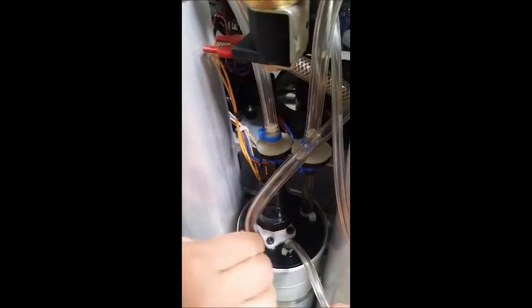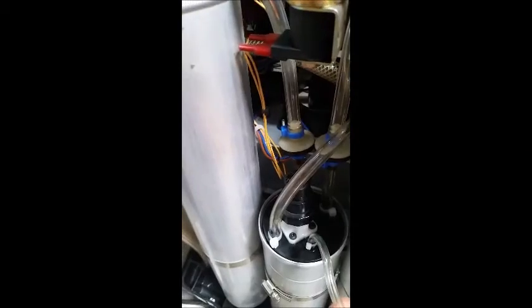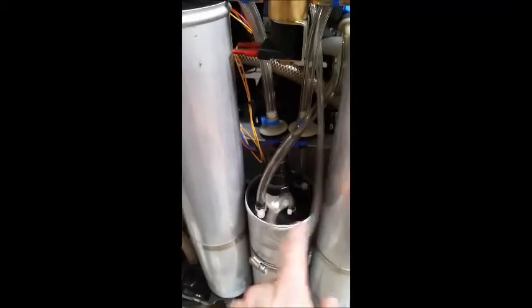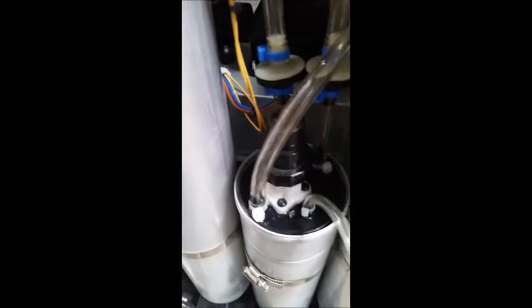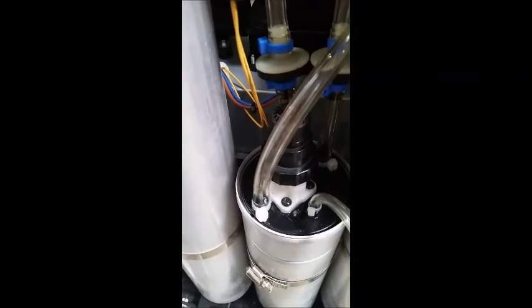We've now replaced the zip tie and cut off the expanded tubing. We'll turn the concentrator back on and retest around the area. You can see this time there's no bubbling, so we have fixed this leaking concentrator.